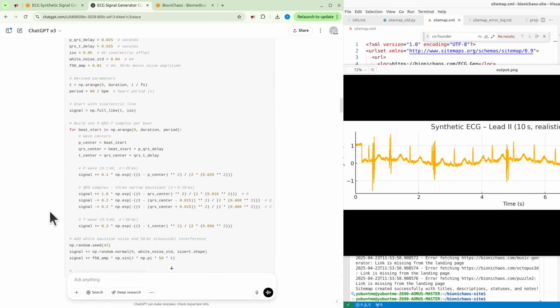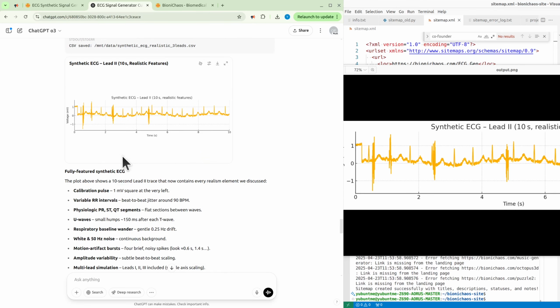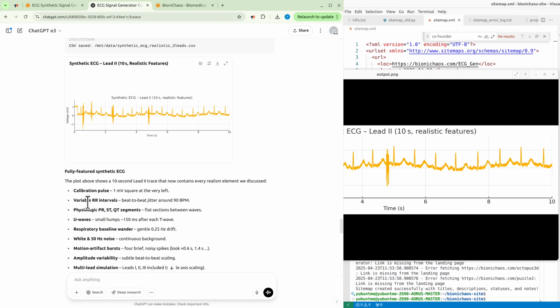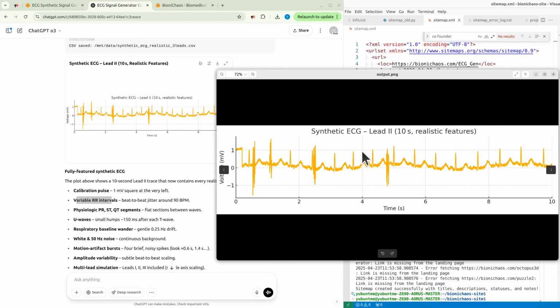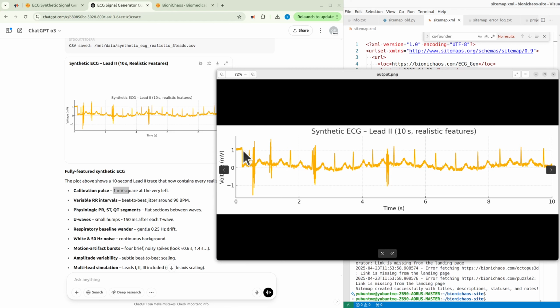Yeah, o3 uses advanced reasoning, and after another prompt, long story short, it was able to generate a hyper realistic ECG waveform. You can see an example of it over here. It has variable RR intervals, so the intervals between the R peaks are variable. Actually measuring it with my thumb, yeah, they look like they are variable. Calibration pulse, 1 millivolt square at the very left. Okay, so it did a calibration pulse for whatever reason.